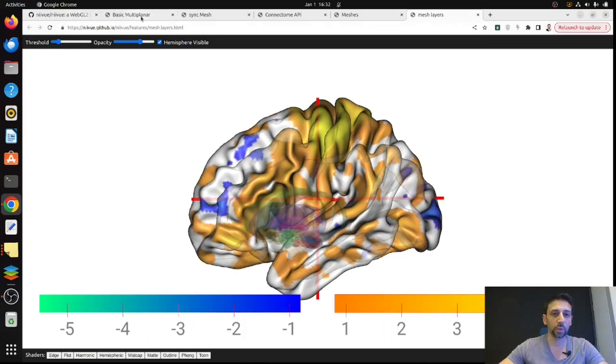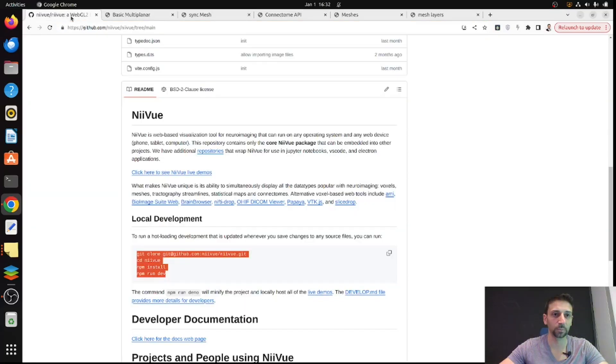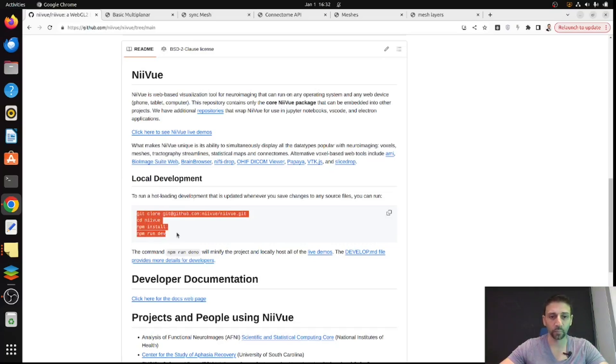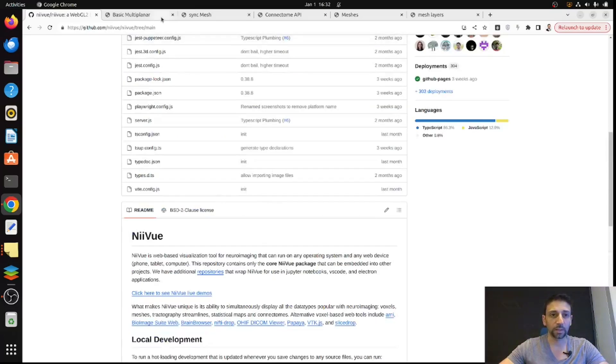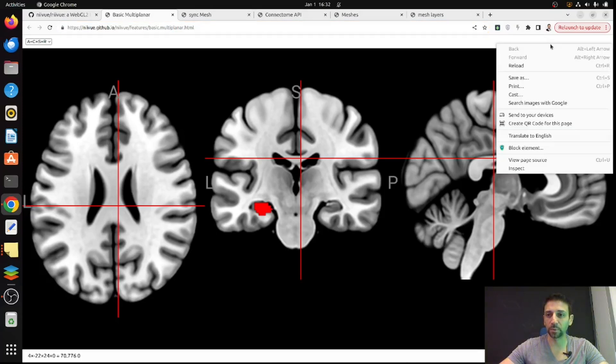Now I'll show you in a simple way how these things work. If you want to run it locally, you can simply clone the GitHub and install it.